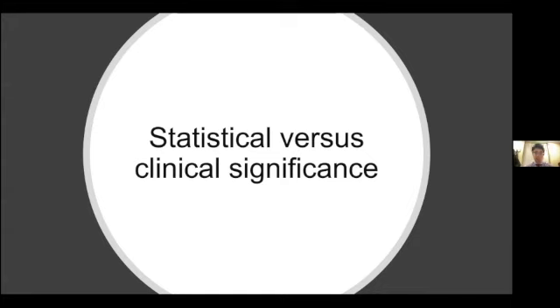And the issue there becomes, let's say you have a high functioning algorithm, what are you going to do with it? For example, in a hypothetical situation, which has played out in real life, if you have a chest CT algorithm that's able to differentiate between COVID-19, non-COVID-19 pneumonia, and other lung disease, and it performs really well, if the chest CT is not really used for that purpose, then that algorithm is not going to be useful. At least in the United States, where chest x-rays are the first line clinical imaging study, and chest CTs are done more to look for pulmonary embolism and other complications, that kind of algorithm doesn't really have any use case.